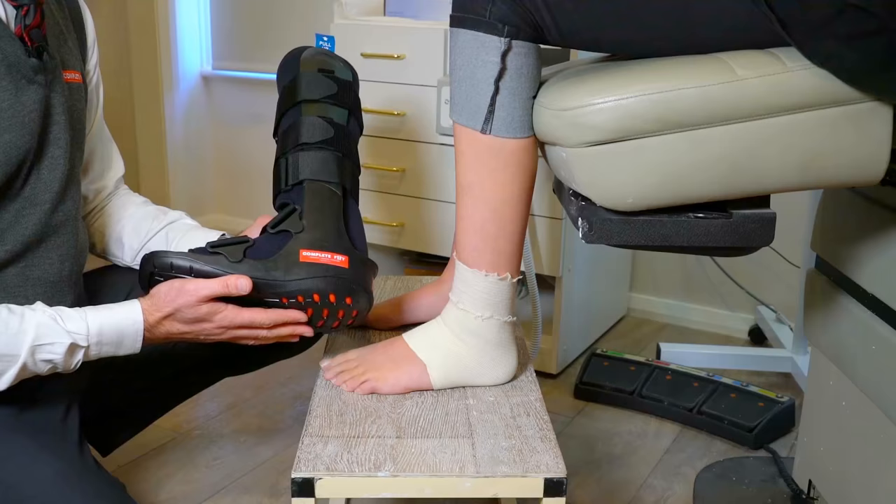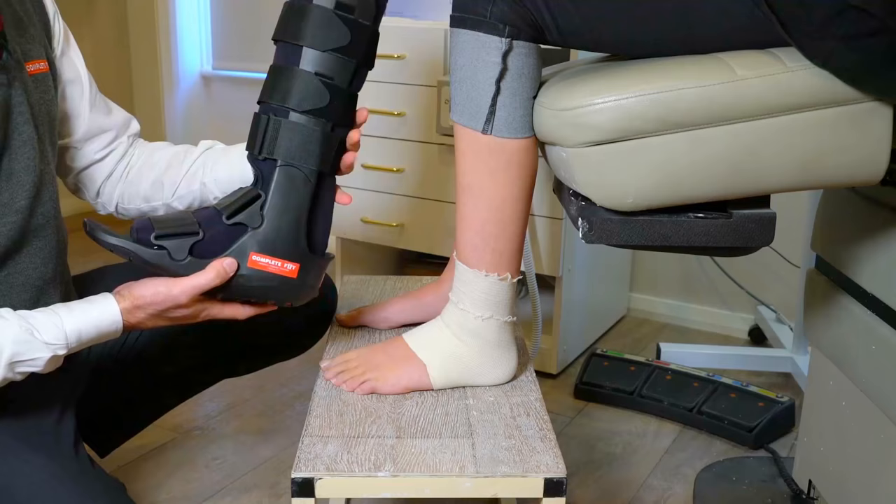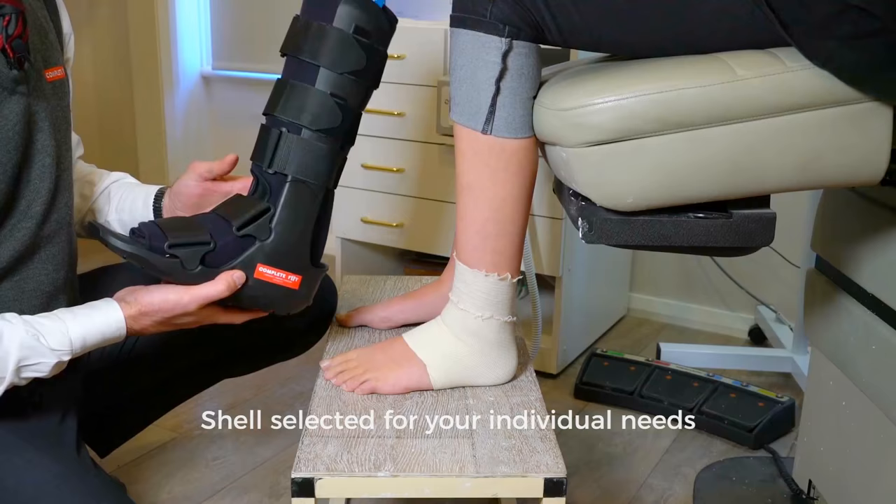This is a standard type of CAM walker. There are others available with pneumatic lining, which means we can pump it up; there's a shorter type; and there's also a type that has an anterior and posterior shell. But this one is the one we prescribed for you, so I'm going to set this up in a moment and then we'll get it fitted for you.